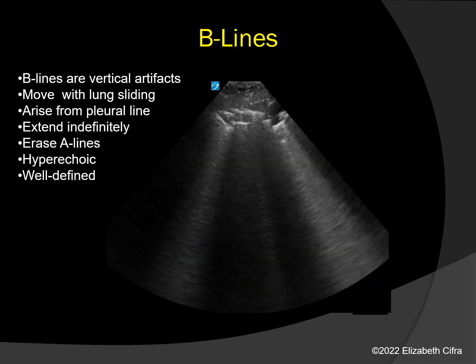The first pathological finding we will be discussing in lung ultrasound are B lines. You will notice these B lines are vertical lines that stem from the pleura surface all the way down to the bottom of the screen. You see several of them listed in this particular example. Again, these are B lines that extend from the pleura all the way vertically to the bottom of the screen.